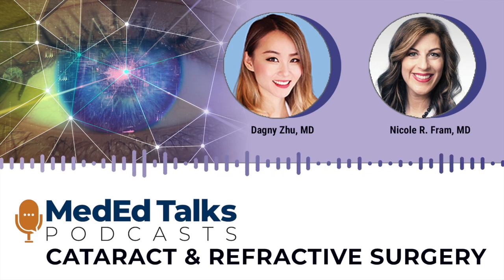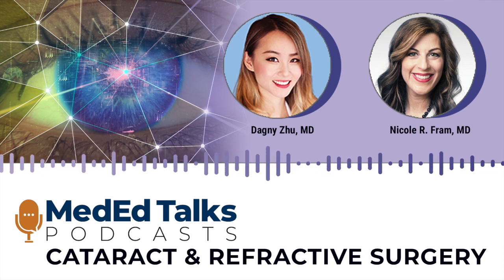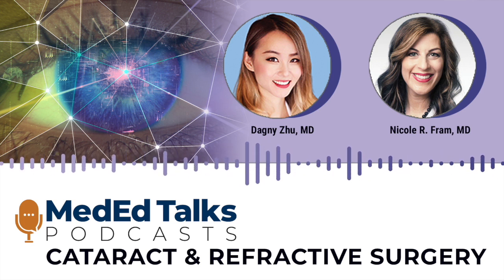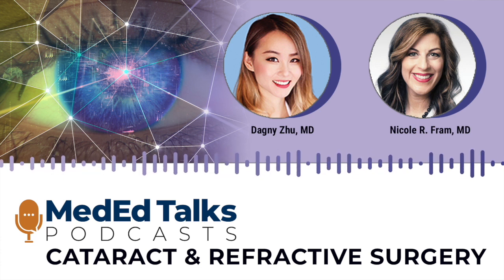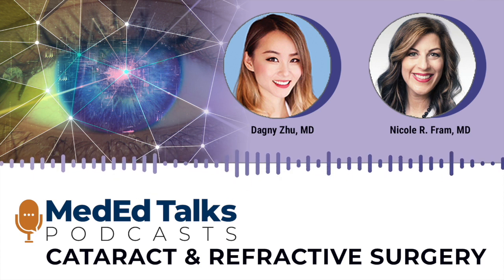And I know some surgeons, Dr. Zaldivar in Argentina, are already using intraoperative OCT for that purpose. So it's very exciting. Hopefully we'll be able to get access to that here one day. But speaking about refractive surgery, there are some other imaging diagnostics that we can use to better improve our screening of refractive candidates. For example, OCT of epithelial thickness, or epithelial thickness mapping. So Nicole, how are you using that? What sort of benefits do you find that provides for your refractive or even cataract patients?